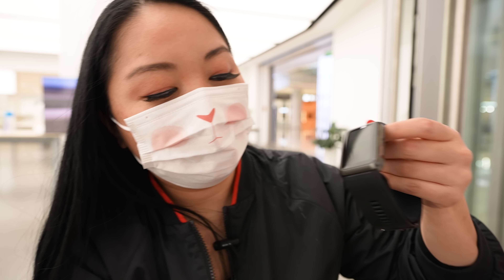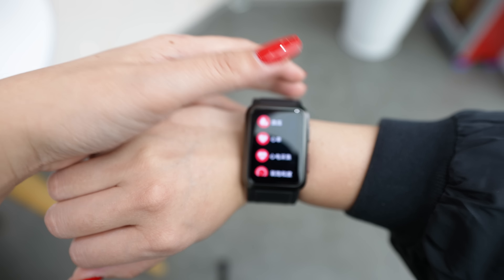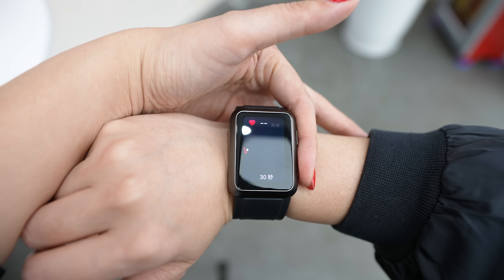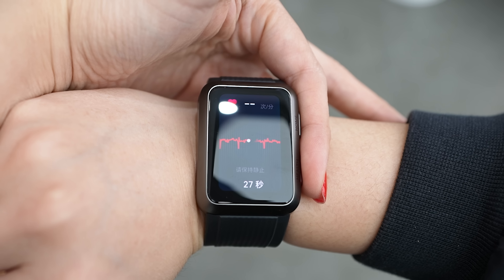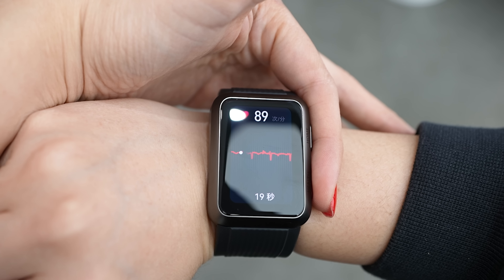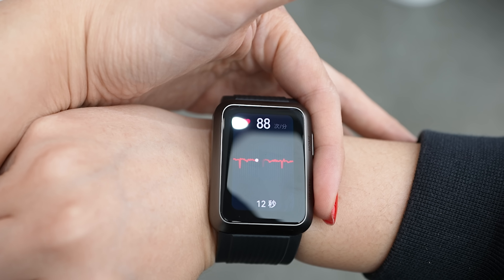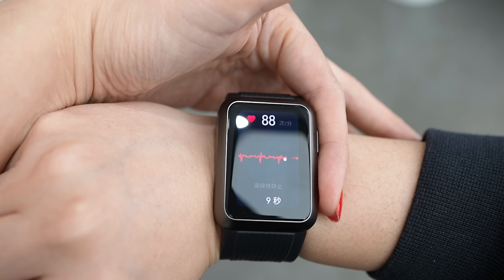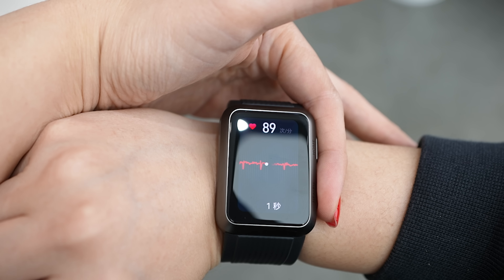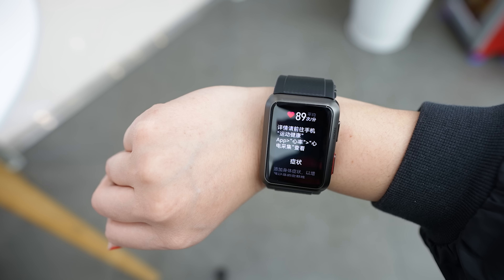Let me show you more details — this was the result, and when it's measuring the pulse you can even feel the heartbeat. I'm going to try the traditional device to see if it's more or less the same. Another function I want to test is the electrocardiogram. You come here, click on the option, and it will give you this information. You need to put your other hand's index finger on the sensor and then wait. After 30 seconds, it will send all your data to the app and you can send it to your doctor.